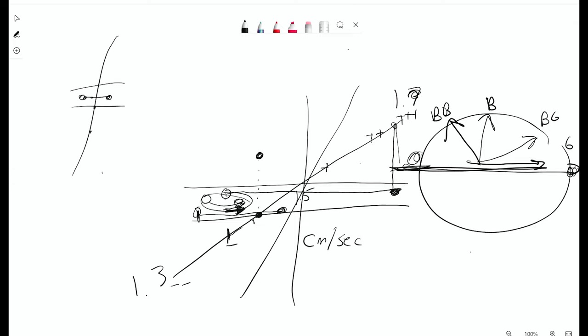And when you do that, I would do triplane. I would do a triplane VIBE sequence, coronal, axial, sagittal, and then you'll be able to go through and see the vessel as being bright at that point. That's always my go-to. Helps to prevent a callback, right? Yeah. And you're not MIPping these, but you're just looking at the vessel as you scroll through those slices. Yeah. Exactly.